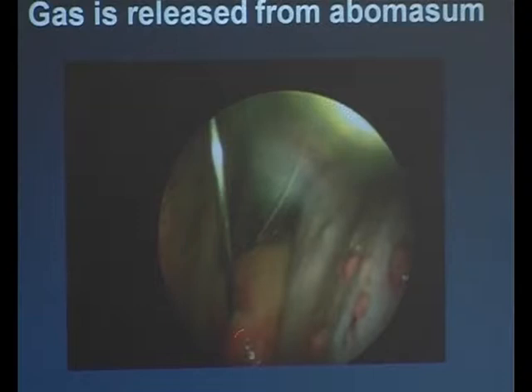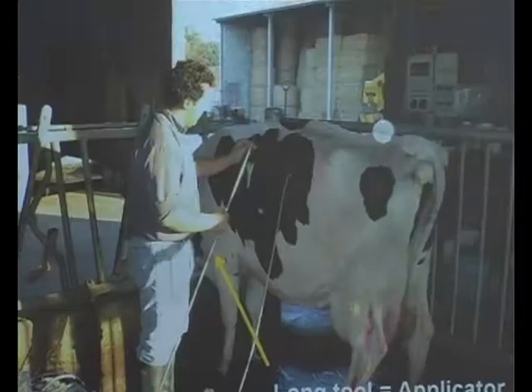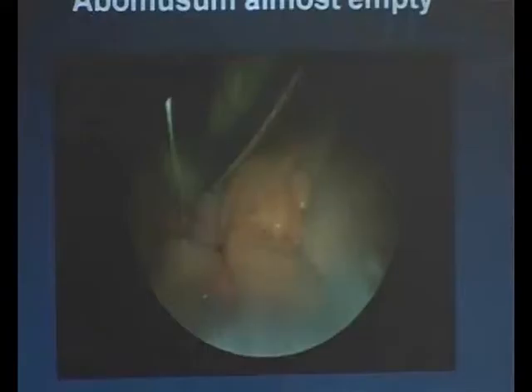And in the live demonstration, perhaps I will show, sometimes we push to the abdominal wall and you push and then the air comes more out. And this is also, you see the omentum, the fat in the omentum. I have to wait, it doesn't pick up. Well, it's a video sequence. You can see again the omentum and the abomasum and the black marks you can see. So you know where you are. I'll try one more. No, it's not going to work. Okay, we see it live.